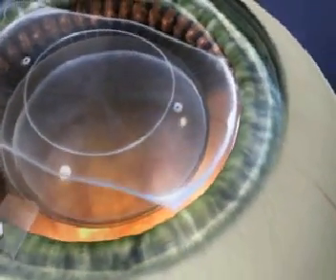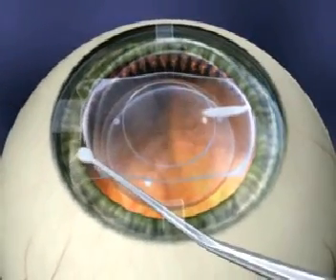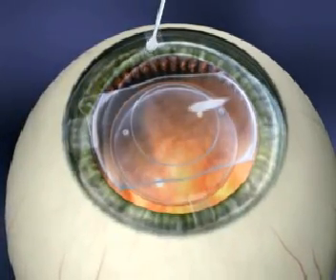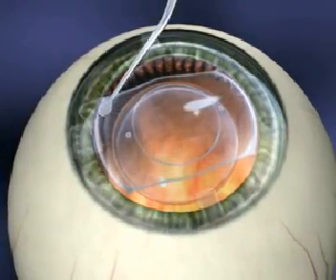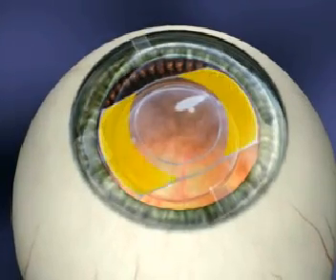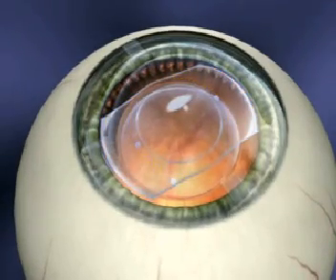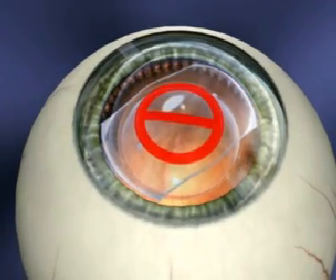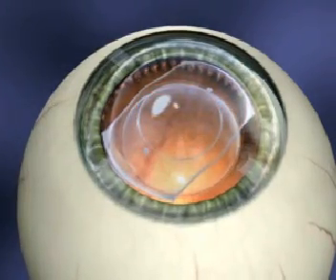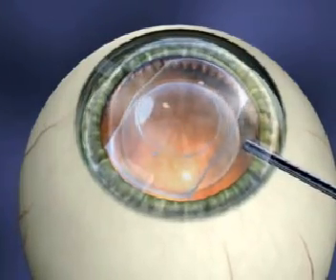Using the ICL manipulator, position the distal footplates first while the pupil is maximally dilated. Once the first footplate is under the iris, continue with each of the footplates until they are all posterior to the iris. Avoid excessive rotation of the ICL once it's in place. Once positioned behind the iris, subtle adjustments are achieved by manipulation on the lens body, between the footplate and optic.